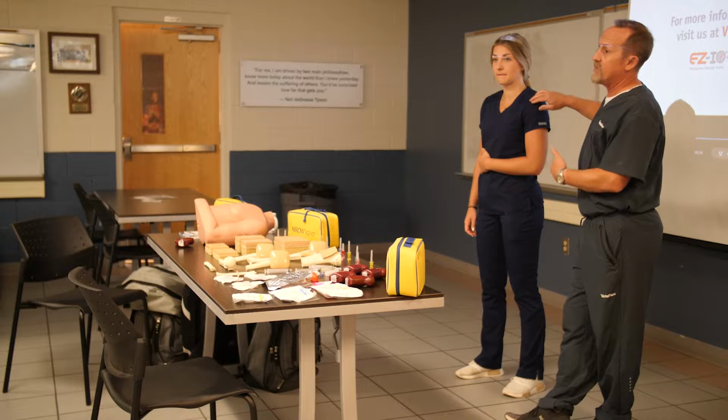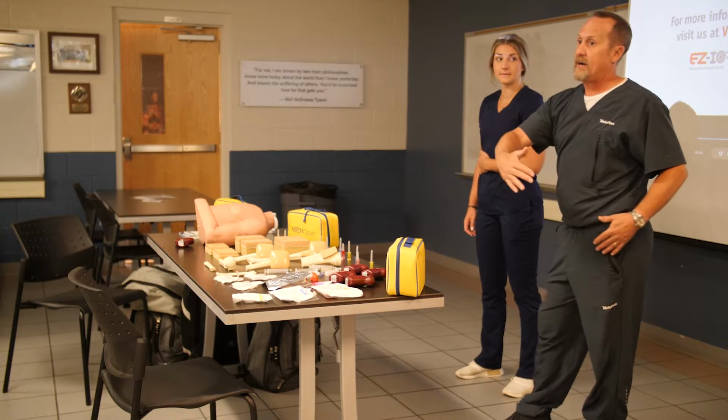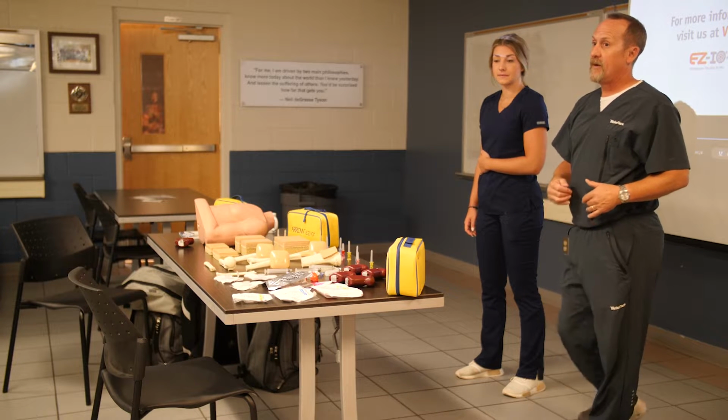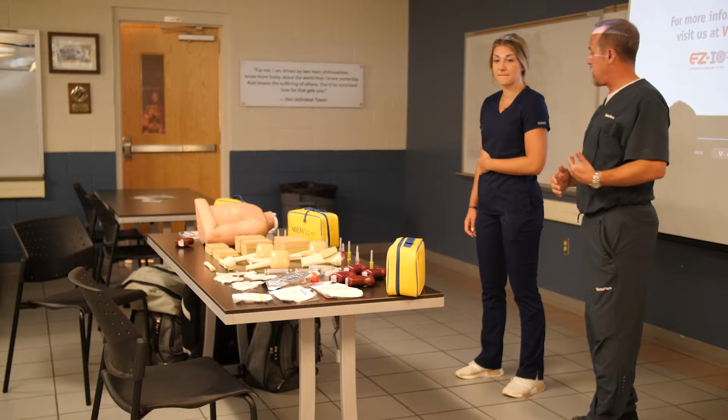But this isn't always very achievable, especially if you guys are using a Lucas, or you've got a pregnant patient, their arm would be way out here and it kind of bundles up that tissue, or you just have a guy with a big beer belly, right? So we've got the arm kind of far away, so it's not always that achievable.